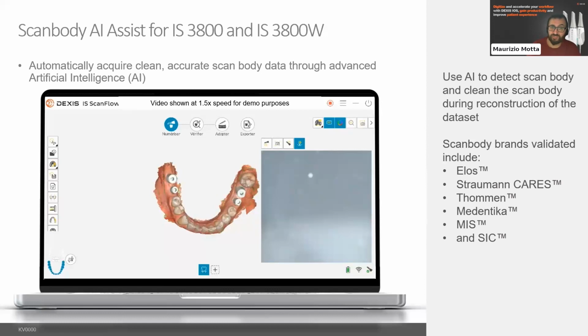And if it still happens, my recommendation is to get in contact with your distributor, with your seller. They have tools that can verify the calibration, and tools that can also collect the log from your PC to verify if this slowness is caused by settings on the computer or something with the scanner.